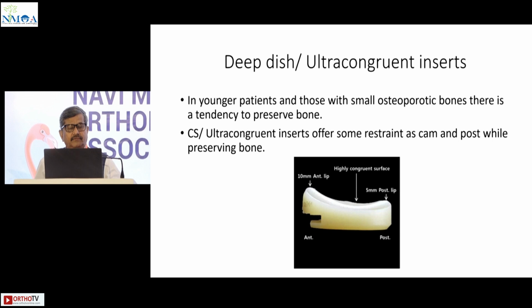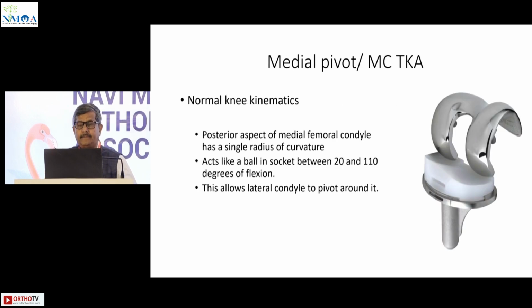A little word about deep dish or ultracongruent inserts. In younger patients and those with small osteoporotic bones, there is a tendency to preserve the bone, and in those cases, CS or ultracongruent inserts offer some restraint as cam and post while preserving the bone.